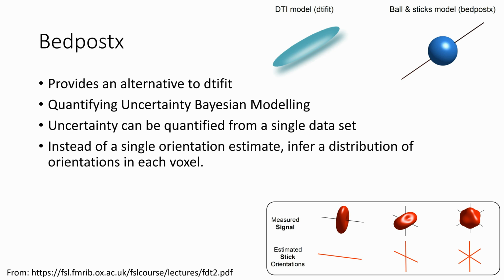If there's an area where those crossing fibers will give you a muckier answer, or you have a break at some point along a fiber bundle, that's going to be picked up with tractography in a way that implicates two brain regions that may be distal. If they have an area that's knocked out, that's going to affect communication between those if there are no direct connecting fibers.